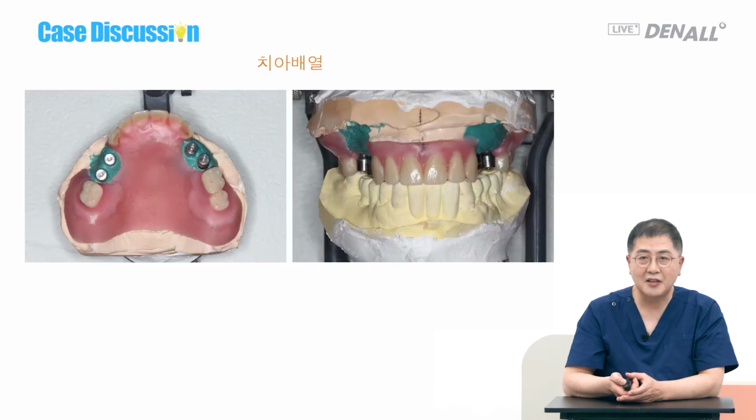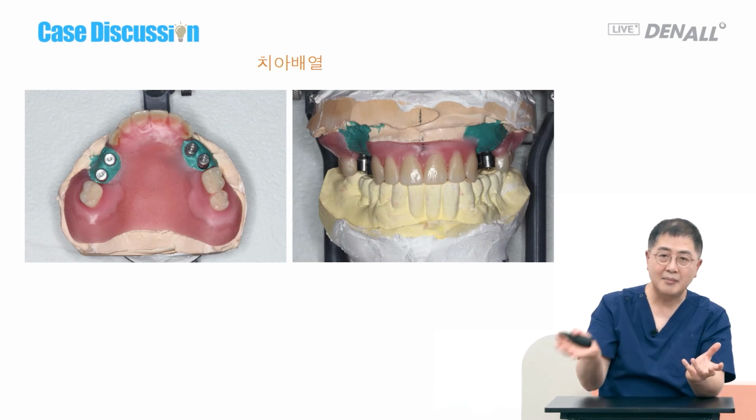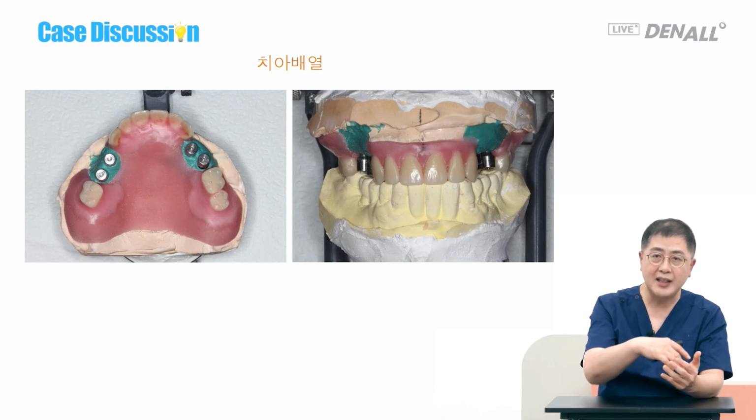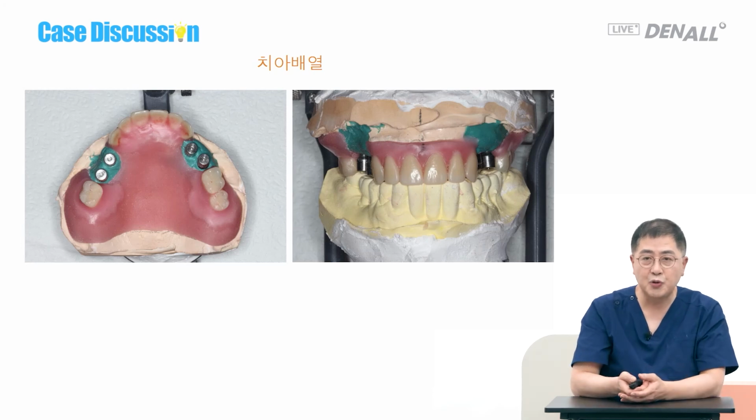So a surveyed crown is used. In this process, the denture should be connected to the implant prosthesis. Therefore, prosthodontic steps are required. That is very important. Therefore, you need to be skilled in the prosthodontic steps.